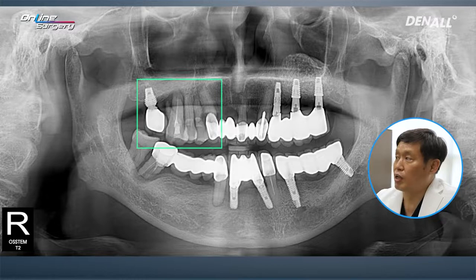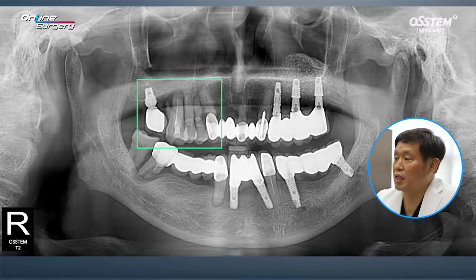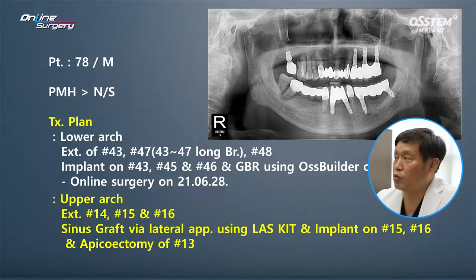There are three teeth, and there are prostheses front and back. Considering the canine root direction, it's too tight to place three implants. Therefore, I decided to place two implants. On CT, in the case of number 13, there was severe periapical lesion.